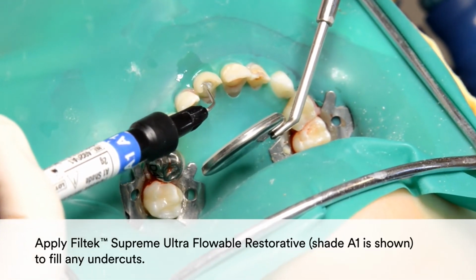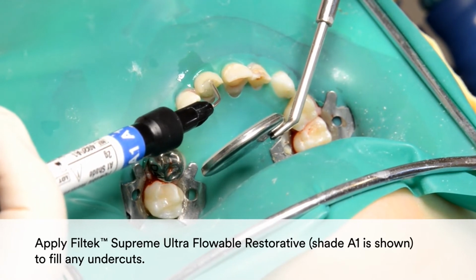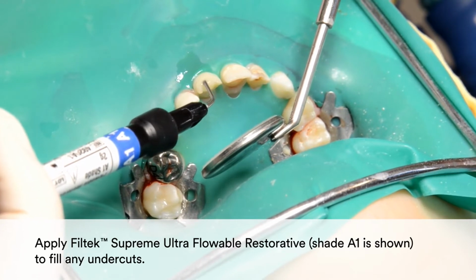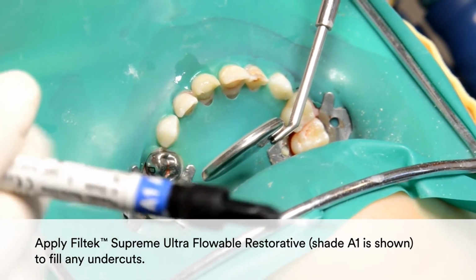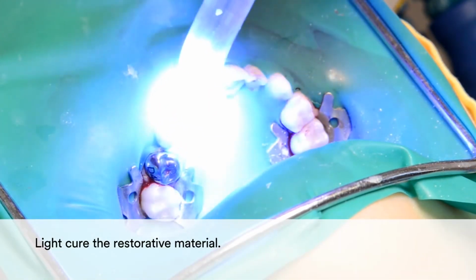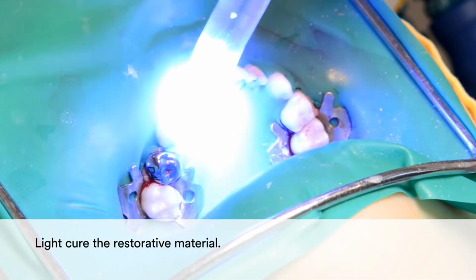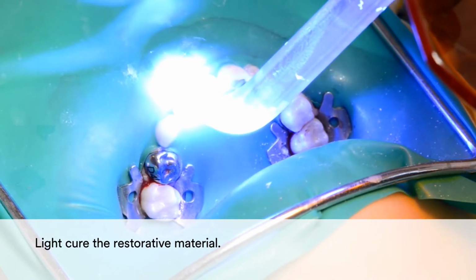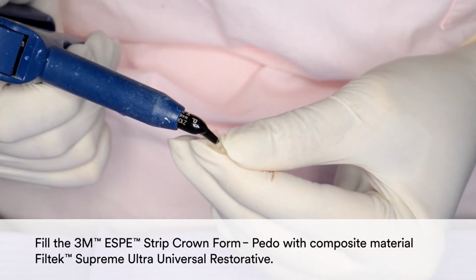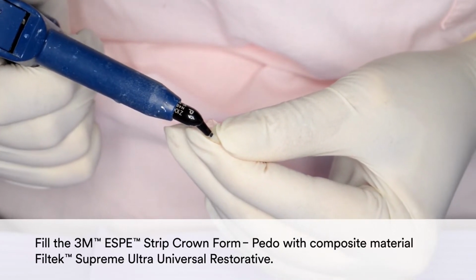Apply Filtek Supreme Ultra Flowable Restorative to fill any undercuts. In this example, shade A1 is shown. Light cure the restorative material. Then fill the 3M strip crown form with composite material, Filtek Supreme Ultra Universal Restorative.